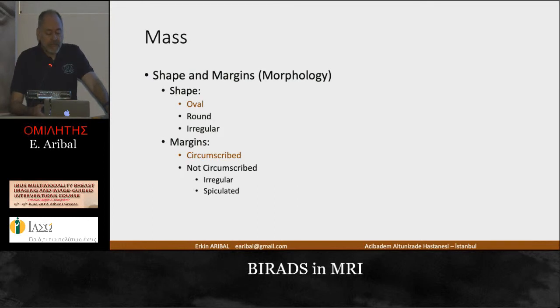We start with the mass. In all three modalities, the definition of the mass is the same.